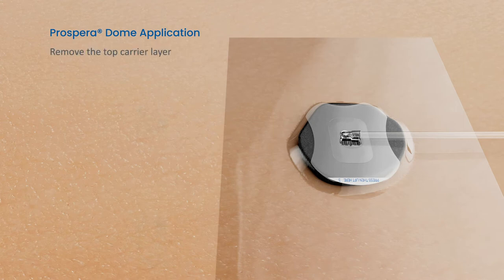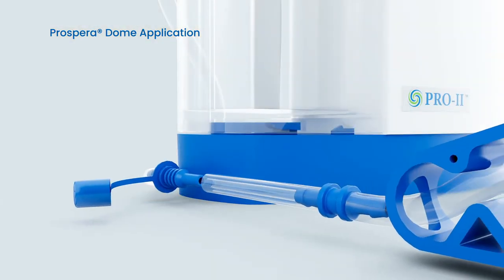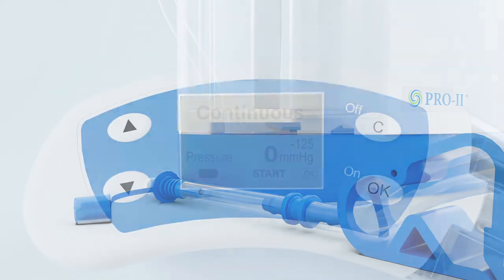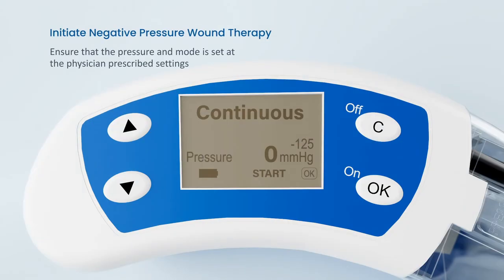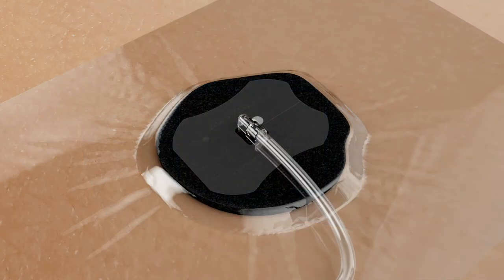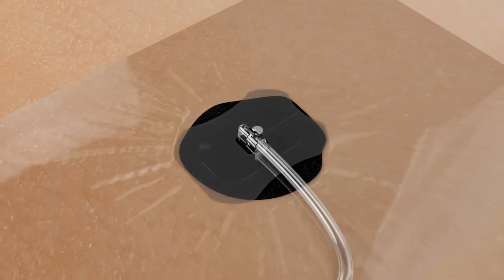Remove the carrier layer 3 from the dome. Connect the dome tubing to the canister tubing, making sure the blue clamp is open. Power on the DeRoyal Pro2 device, confirm settings, and press ON-OK to initiate therapy. Once therapy is initiated, the wound filler, dome, and drape will start to compress.